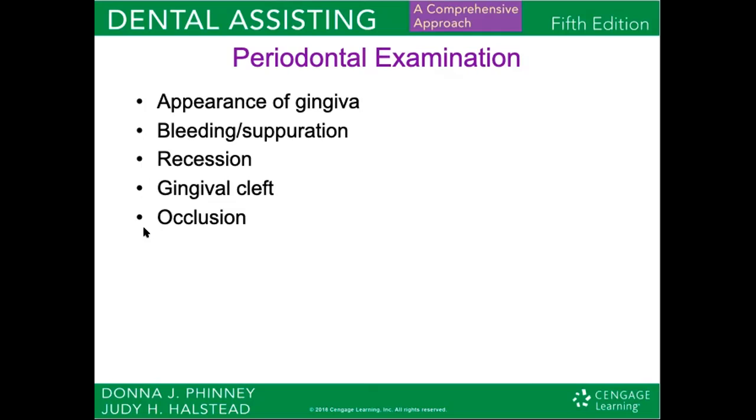Occlusion is described and checked with articulating paper or wax to identify excessive biting and chewing.